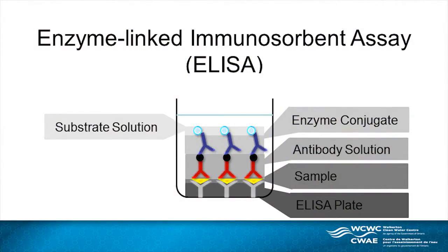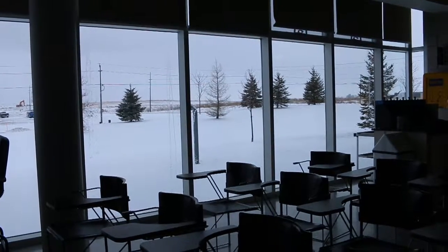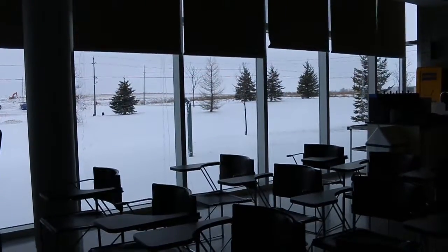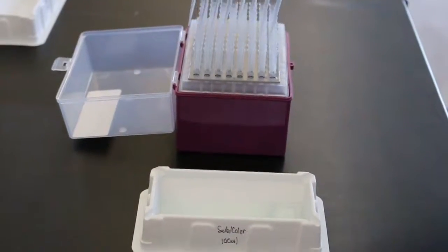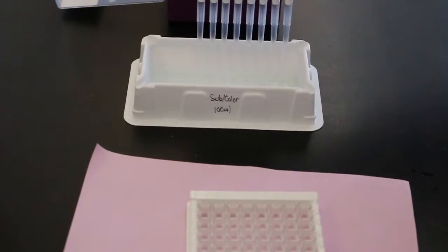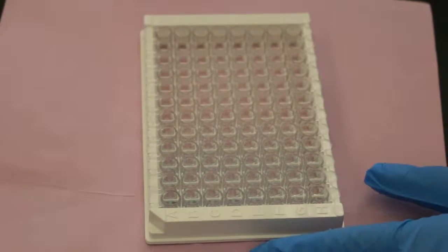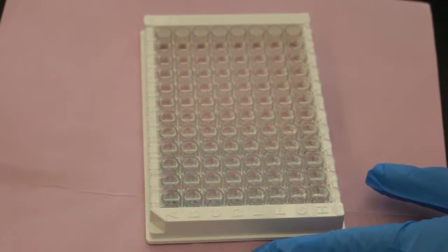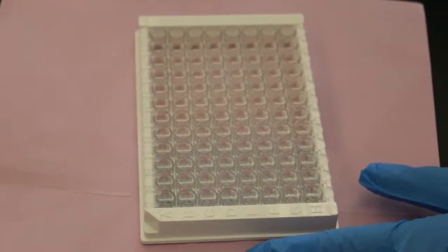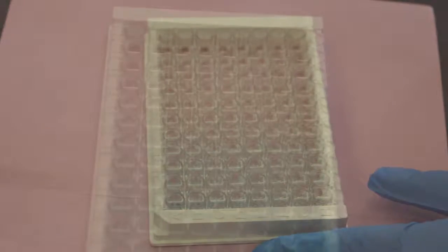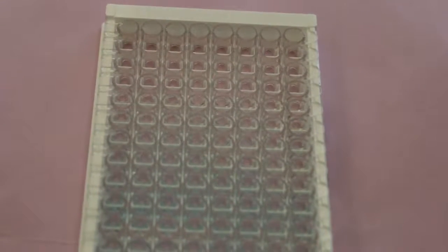The substrate solution is inverted several times and poured into a clean tray. This solution is light-sensitive and must be protected from direct sunlight. 100 microliters of substrate solution is added into all of the wells using a multi-channel pipette. Upon this addition, you will see the wells tint blue. The samples containing higher levels of toxins will appear clearer than the samples with lower levels of toxins, which will be tinted a brighter blue.